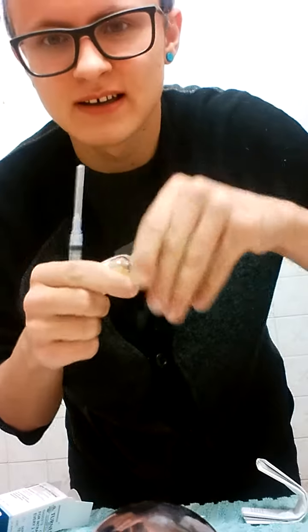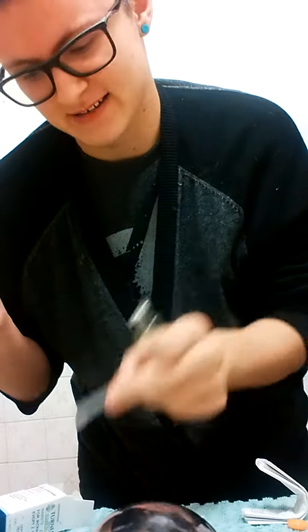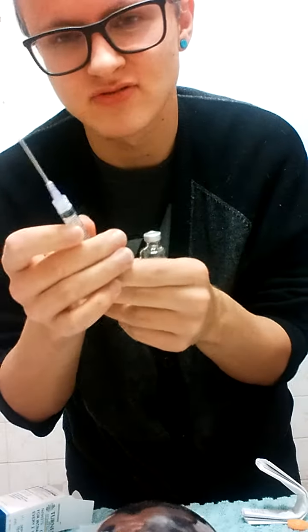You take the cap off. I don't really see the point of alcohol swabbing it if it's new, but you're meant to alcohol swab it to make sure it's clean.